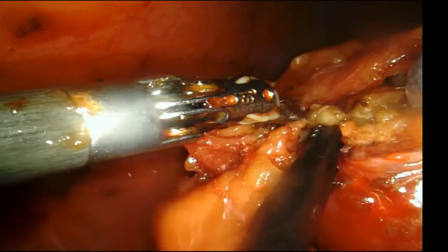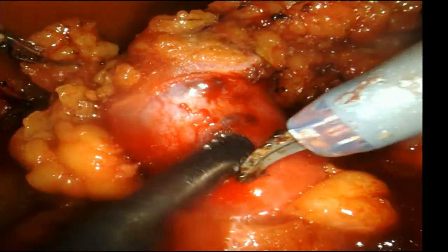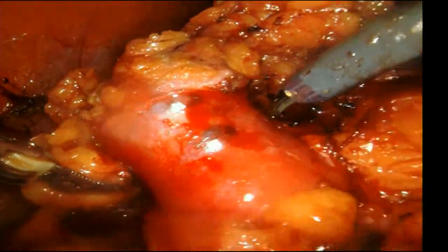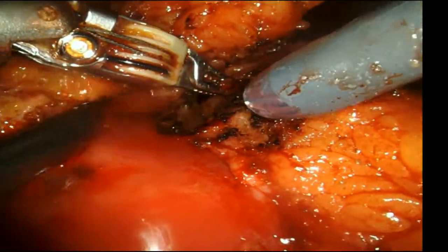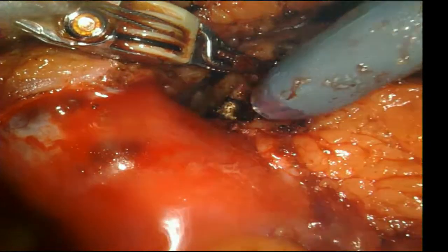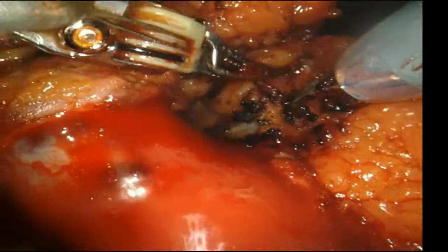But this is all part of your exposure. You're really spending the time to make your resection that much easier. Yeah, you've got to do it. Some people would be tempted right now and say, oh, I can do it right now. Look, I'll cut the tumor out. But then you haven't cleaned off the fat on the backside. So once you get to the backside, you're just going to see a big wad of fat, and you're not going to know where the tumor ends, and you know where the kidney is back there. So you've got to spend the time. You've got to get things lined up for yourself and spend the time to really idealize it before you go on clamp.